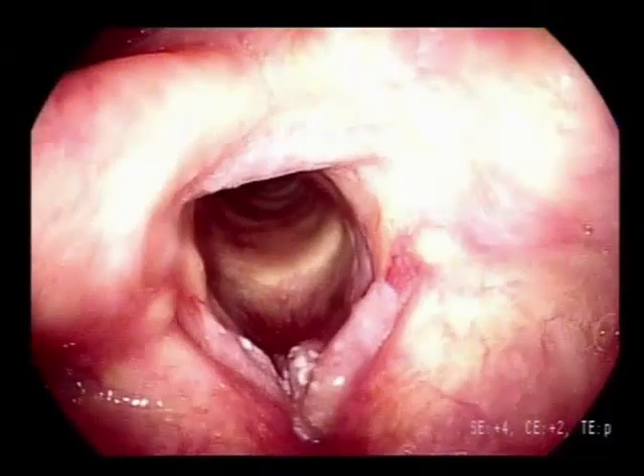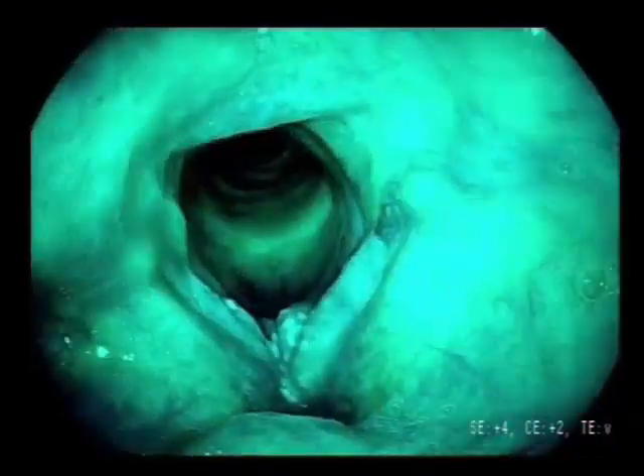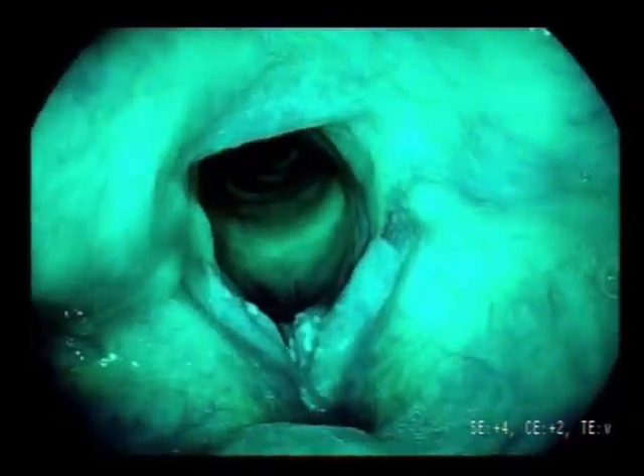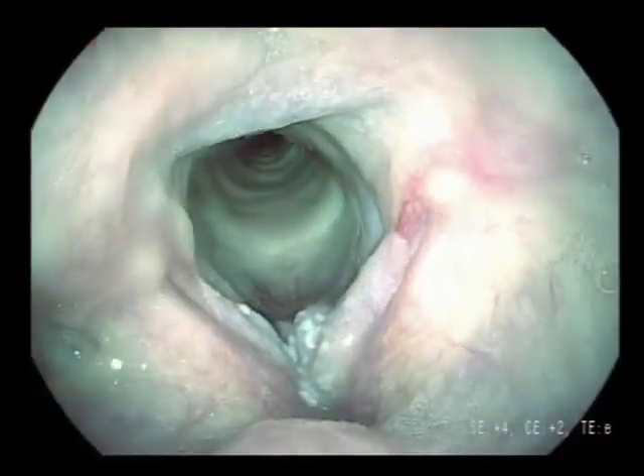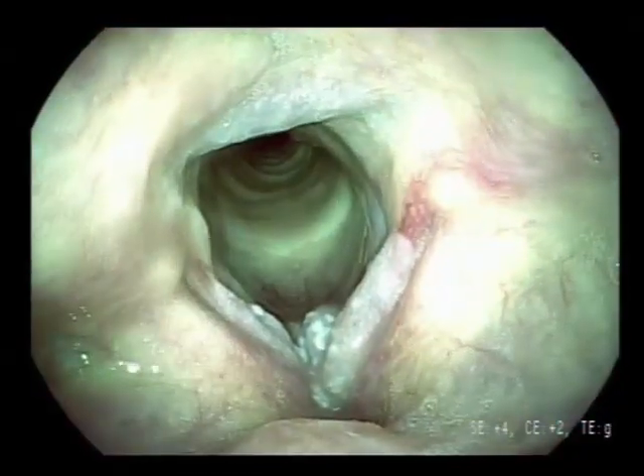With the recent introduction of virtual chromoendoscopy, such as i-scan from Pentax, it is possible to determine tumor boundaries more adequately and visualize vascular structures.